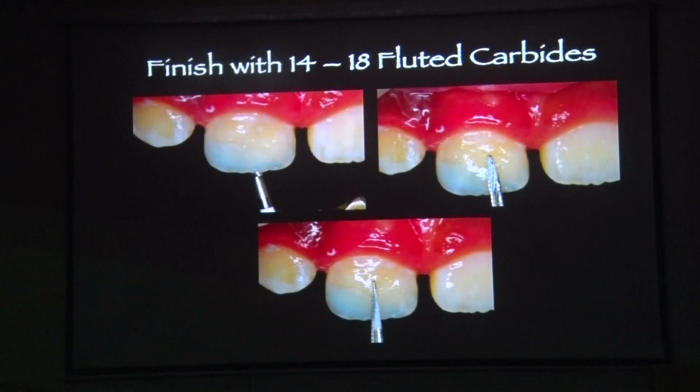Finishing and polishing is the most ignored aspect when it comes to composite dentistry. I see many people just use one carbide burr and send the patient. Then what do you expect? Then we blame the material, that this composite doesn't work in these colors. It's a simple rule of thumb. If you take 20 minutes for a build-up, you take 20 minutes for finishing and polishing. You need to follow the protocol.